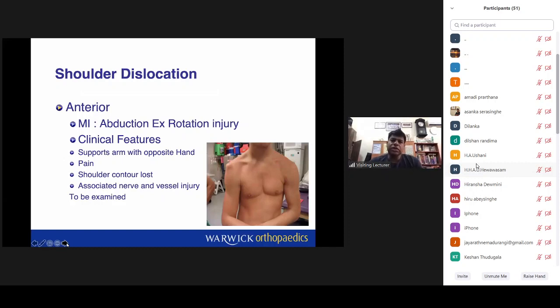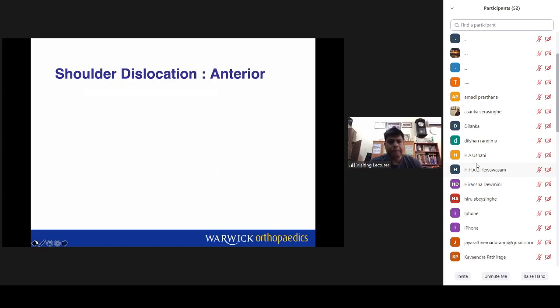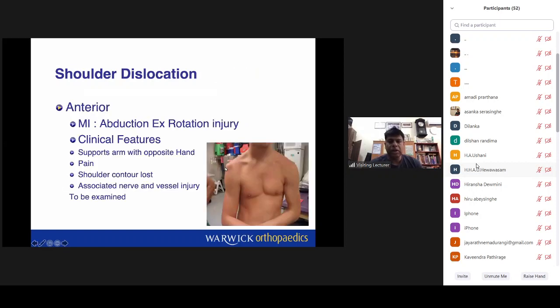Usually, the patient knows, feels that it has popped out. And if you look, you can see the normal contour of the shoulder here. This contour is lost. It's flat. Glenoid is empty. This is called the empty glenoid sign. And always compare the opposite side.